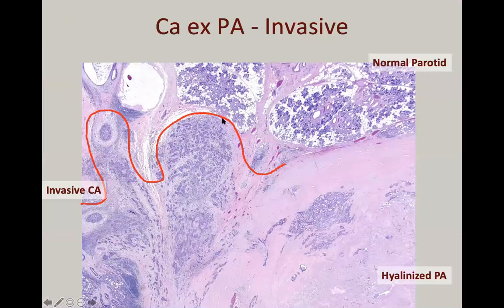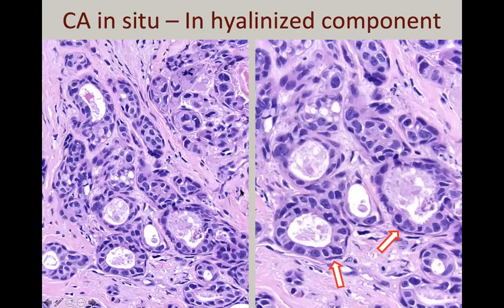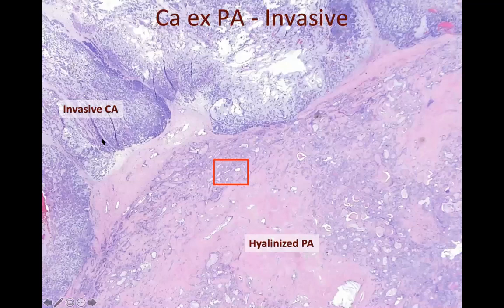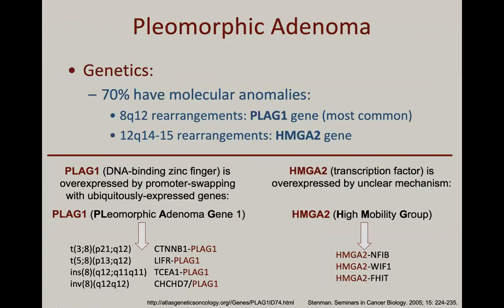But once you have, again, this breaking of the boundary and invasive lobules into the adjacent stroma, here's your adjacent benign pre-existing pleomorphic adenoma on the bottom right. This is now a high-grade invasive carcinoma and should be treated aggressively. So again, on higher power, showing you a box here of the pre-existing pleomorphic adenoma from whence that malignancy arose within the ductal system. And then it started to invade outside on the top left into this invasive carcinoma. So that's how PAs transform. They transform within the ductal system and then they invade. I can skip this. This is all right.